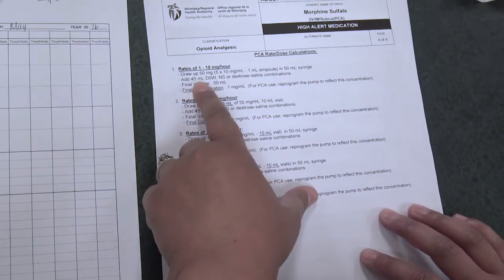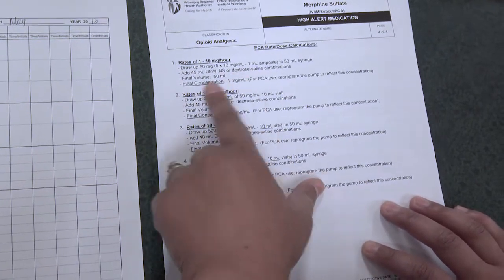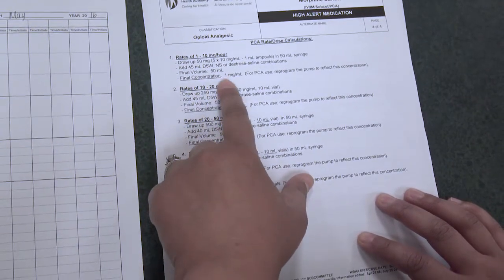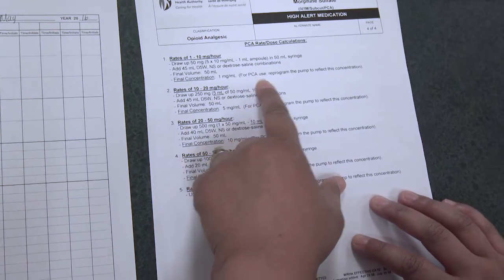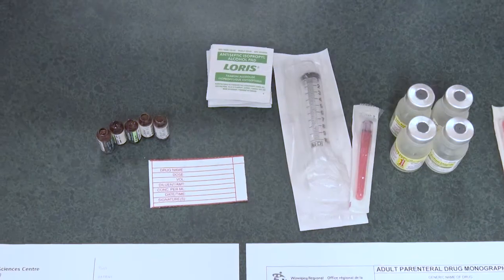Add 45 milliliters of D5W, normal saline, or dextrose-saline combinations. Your final volume is 50 milliliters, and your final concentration is 1 milligram per milliliter. This is for PCA use, and you have to reprogram the pump to reflect this concentration. So let's gather our supplies.